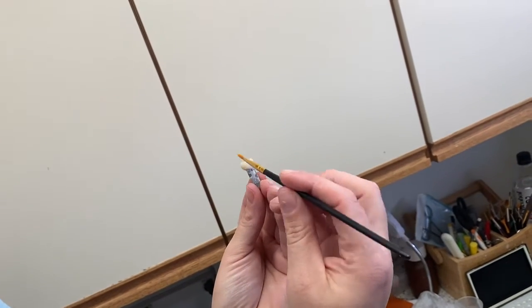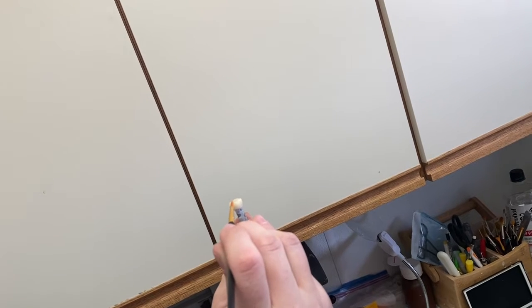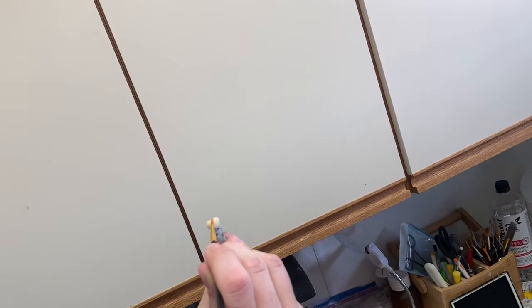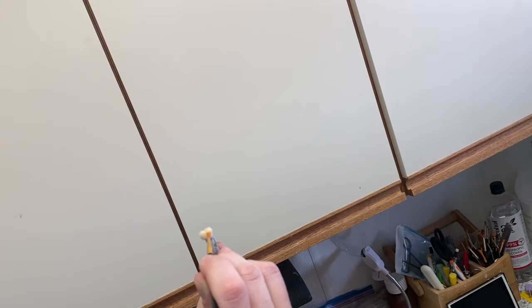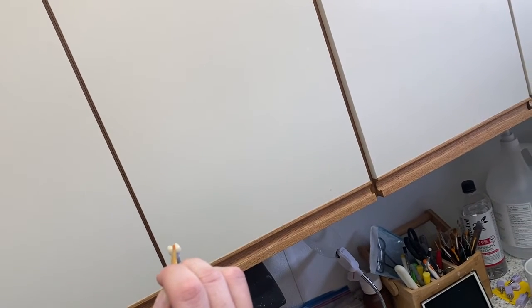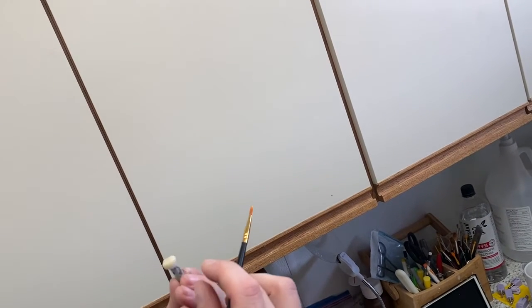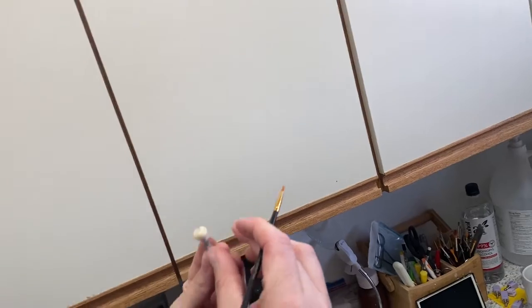Finger rest. Stick your little pinky out. Yeah, there you go. See how that just steadies your hand? You can't really do too much glaze, but the more glaze you put on, the more chance you have to trap air bubbles. And air bubbles will break, and then they'll leave a real rough surface.